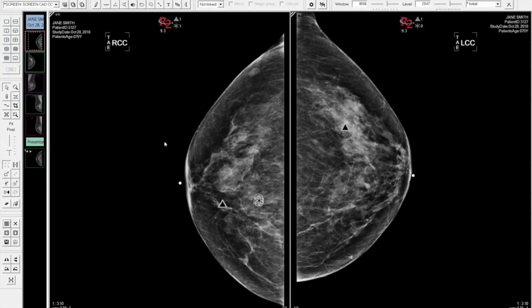So this is probably a good time for me to pause. There's much more to go, but I want to pause, and if anyone wants to type in a question, here's a good opportunity. And if nothing happens in about 30 seconds, I'm going to resume, and then of course at the end we'll circle back around and allow questions.